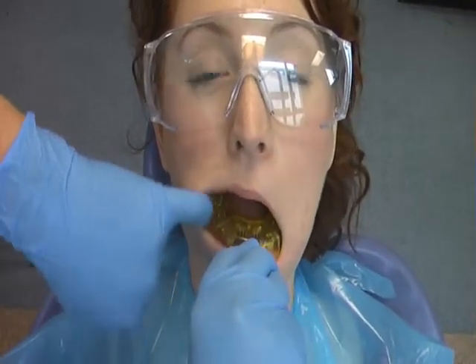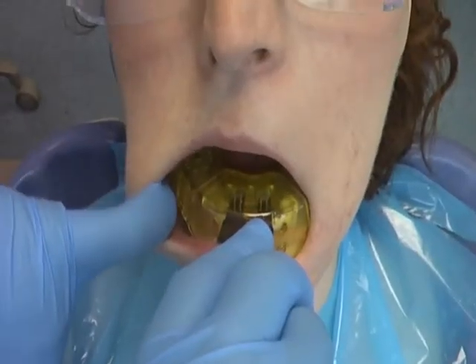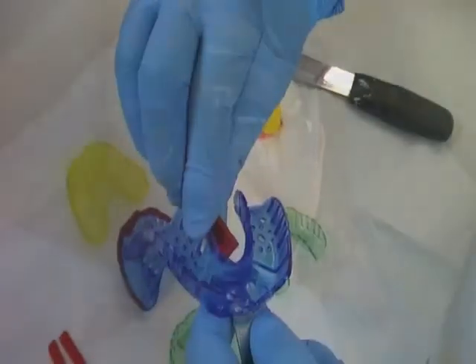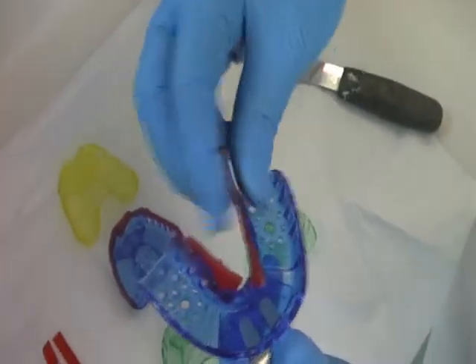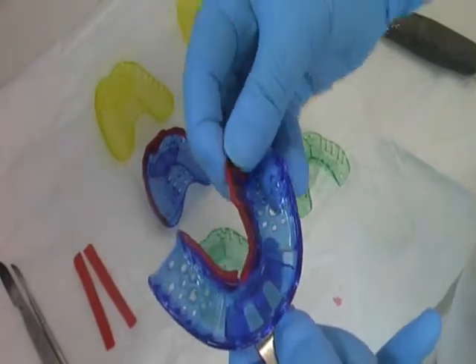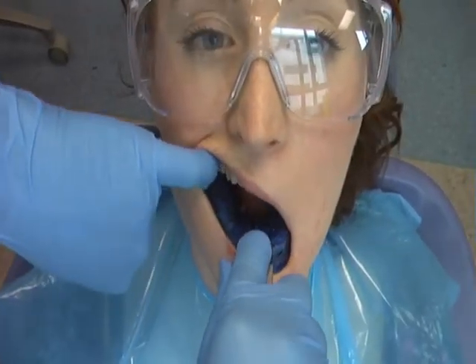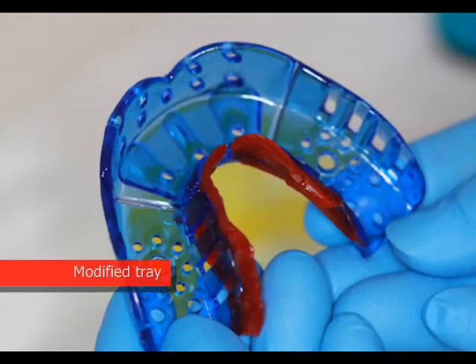Like the upper tray, the lower tray must also be tried in the patient's mouth before loading with the impression material. Particularly note the position of the tongue when the tray is fully seated. Border extension should also be noted. Ribbon wax is moulded in areas of the tray that are underextended. Examine the modified tray in the patient's mouth and ask the patient to move their tongue, as this can help you identify areas of interference.